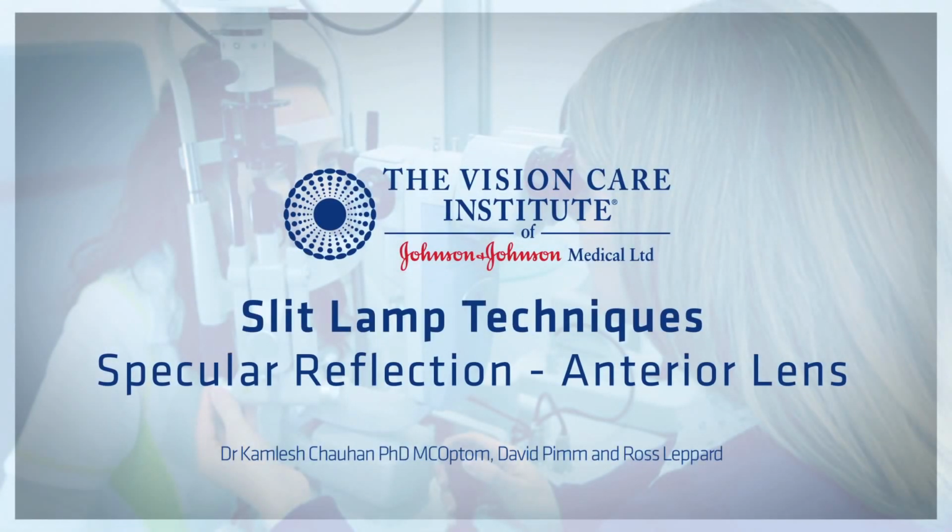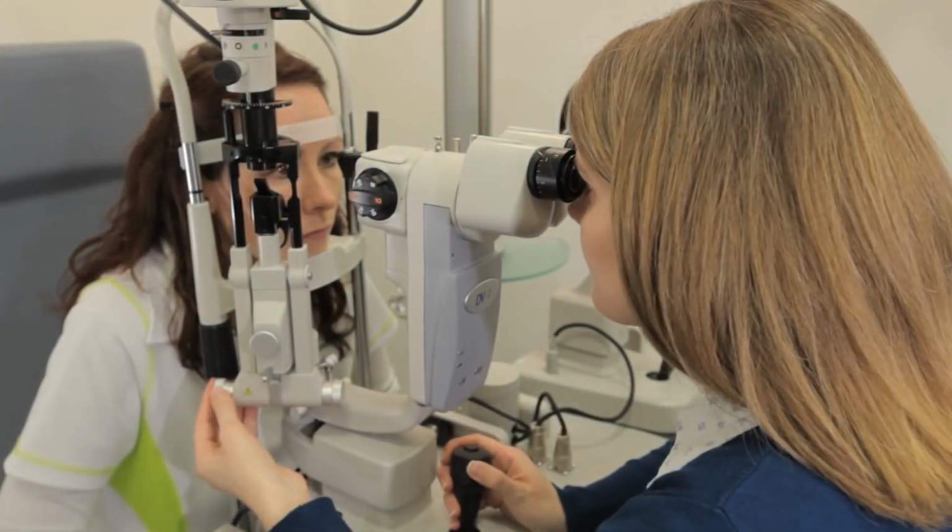Visualizing the anterior surface of the crystalline lens is a useful technique because it allows the practitioner to see the quality of the anterior surface of the lens and whether there is any deposition due to, for example, a disease process such as anterior uveitis.